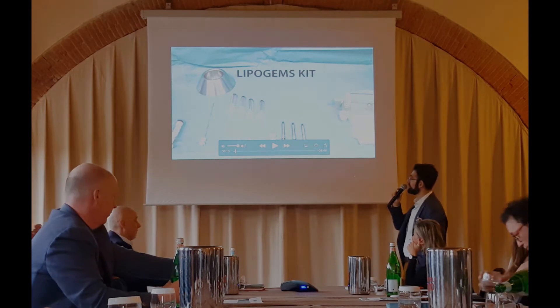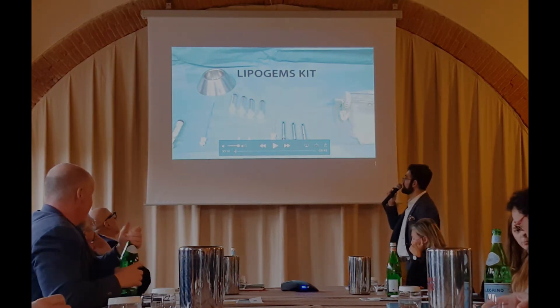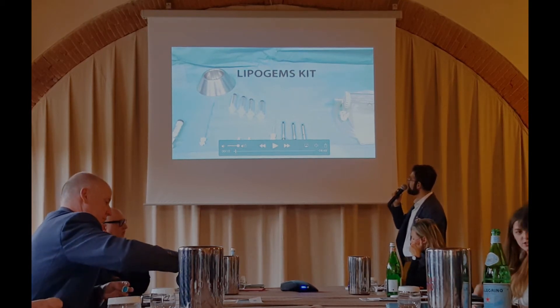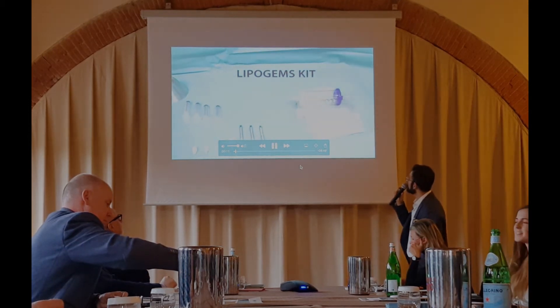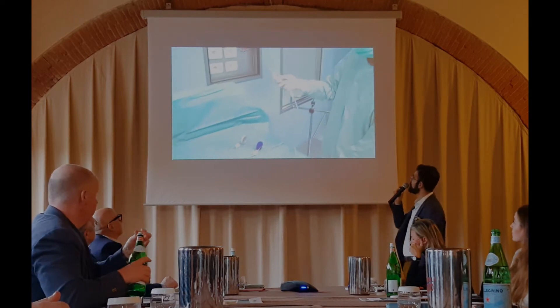This is the kit. You can see it includes three disposable cannulas, one 20cc luer-lock syringe, two 60cc luer-lock syringes, and two luer-lock 10cc syringes.